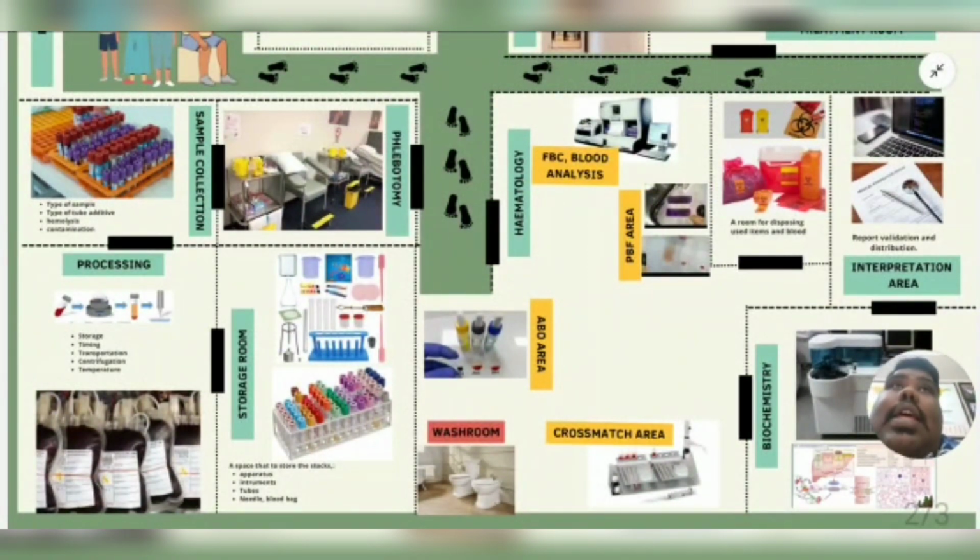Okay. And the result must be checked by the head of the department and the lab director as well before it is released to the patients and interpreted to them.